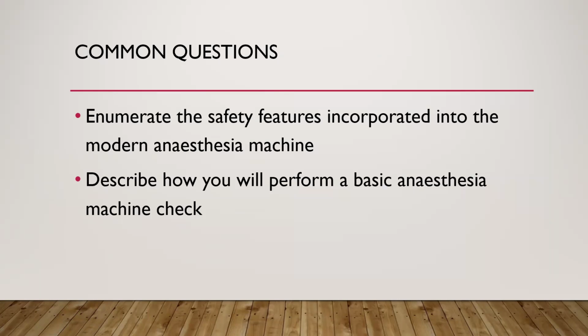All right. So the question, very briefly: enumerate the safety features incorporated into the modern anesthesia machine. Quickly, I need 10 people to say one each. What are the safety features that have been incorporated into the modern anesthesia machine? Quickly, our time is gone. The monitors. Alarm device, I'll take alarm device. I won't take monitor. Color coding, I'll take color coding too.